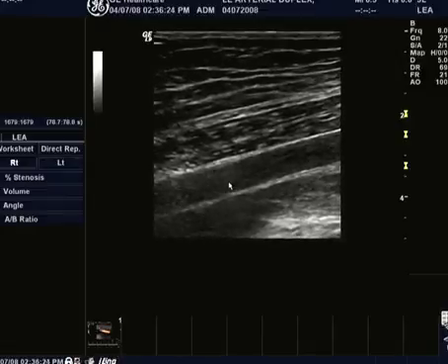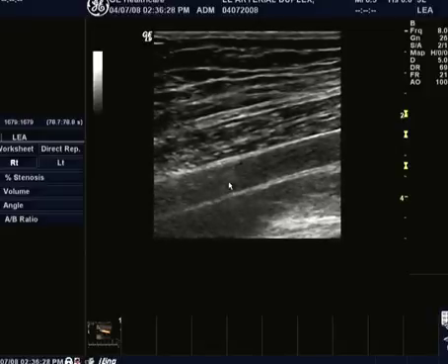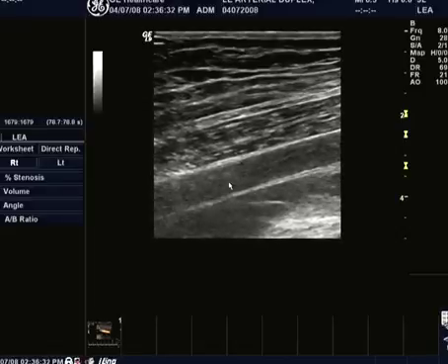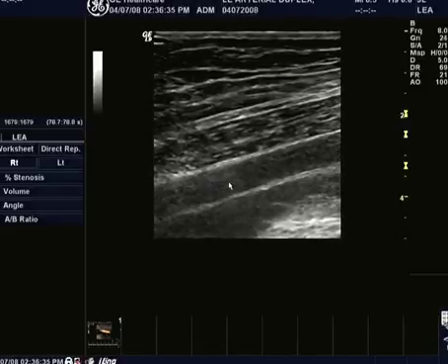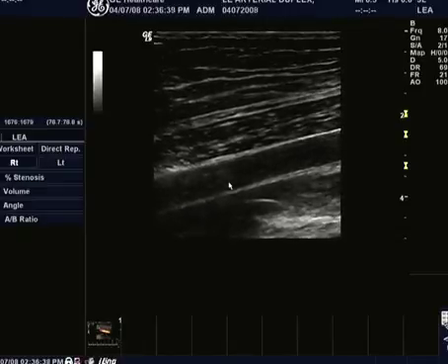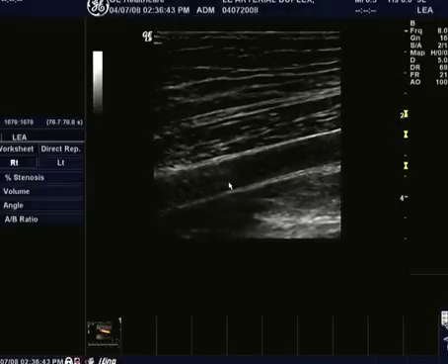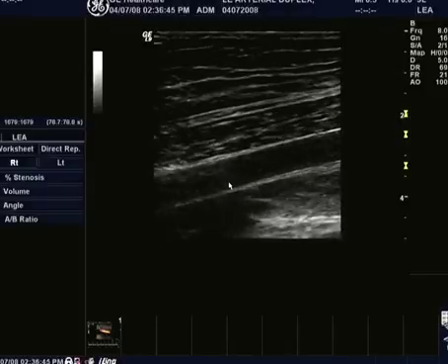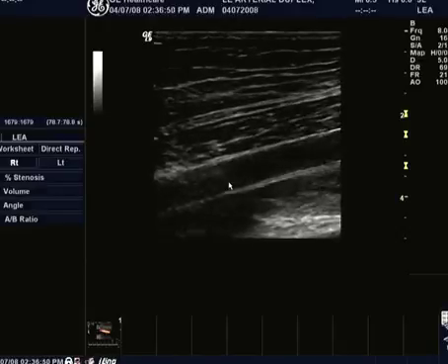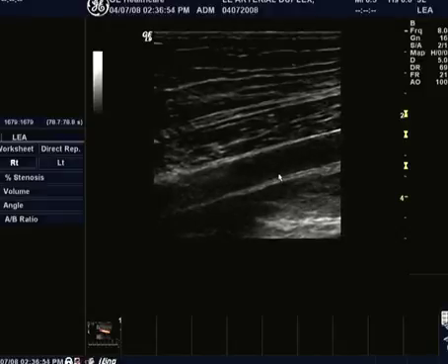We don't want to have our gain increase too much, and I'm going to increase the grayscale or B mode gain. You can see now that the vessel fills in with a lot of echoes. That's really not too helpful. We want to back this down so our vessel lumen is nice and black and clear. We'll do this with an overall gain. We can do this with the DGCs. We want to make sure that, again, the focal zones are appropriate so that we are optimizing that image, so that if there were plaque here we could bring out that plaque.